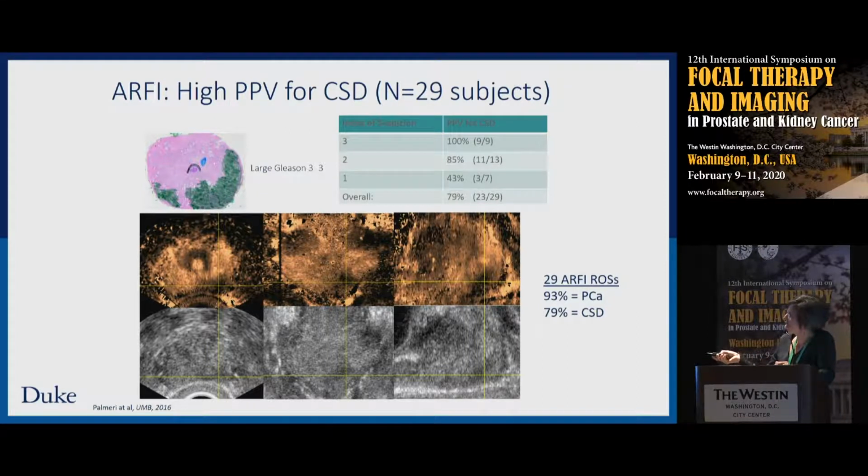And we can also see a region that is asymmetrically dark, or which didn't move as far, so it's stiffer in this image. These ARFI images, where we're just looking on axis, are showing relative differences in the response, so it's not a quantitative measure, but it's demonstrating that, in fact, we do a nice job of visualizing prostate cancer. Here was a large Gleason 6 cancer. And we can see this in multiple views.